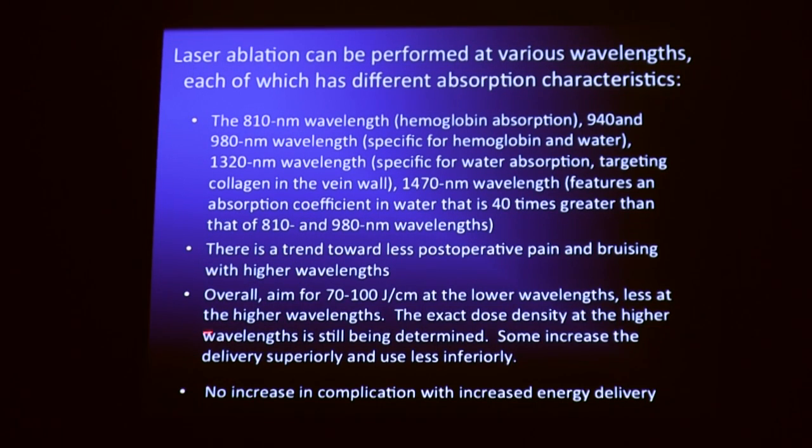That's it. So laser we use at a variety of wavelengths. Laser technology is changing. We can't even describe just laser because there's so much detail to it. But laser and radio frequency both work fabulously in the vein. That's very different than the lasers you think about on the outside, like hair laser removal or any of that stuff. This is a different type of laser.